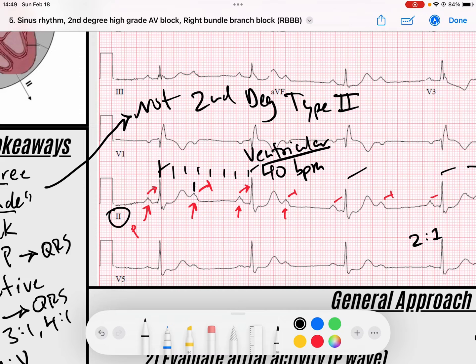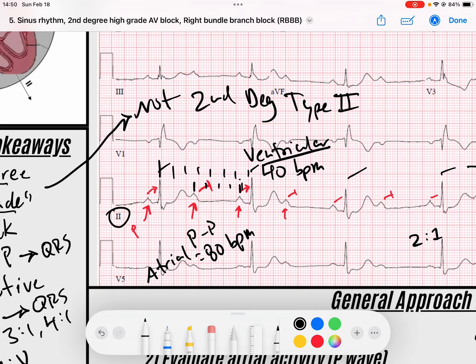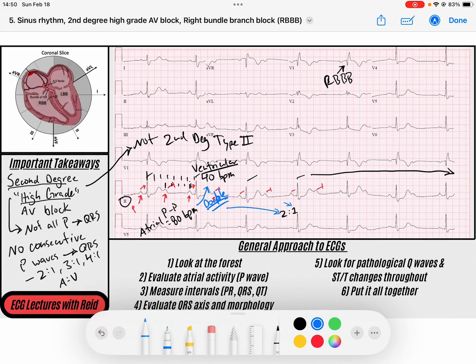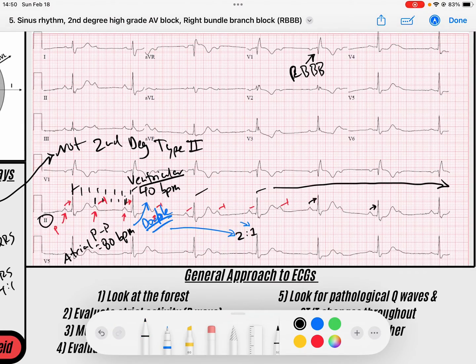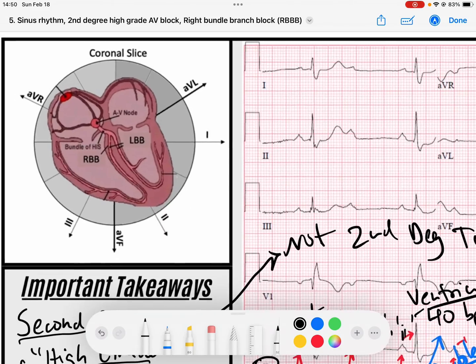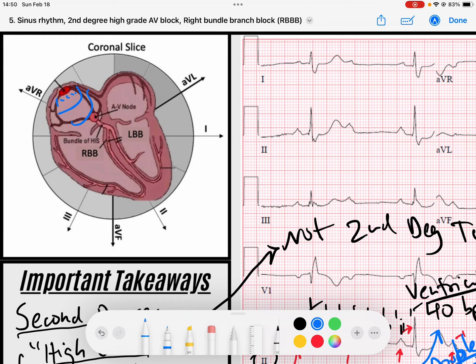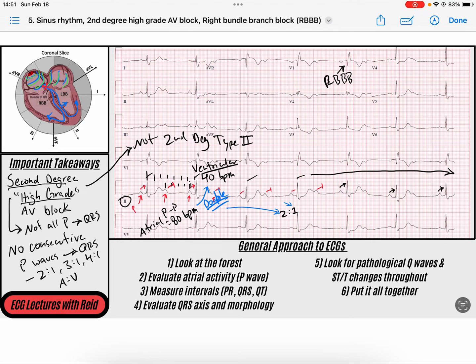The atrial rate — measuring P to P — comes out to about 80 beats per minute. Notice the atrial rate is double the ventricular rate. That's because we have two P waves for every one QRS, with every other P wave conducting. This confirms a regular 2 to 1 pattern throughout the rhythm. A P wave conducts to the ventricles, then a P wave gets blocked, and the cycle repeats — that's our 2 to 1 second degree high grade AV block.